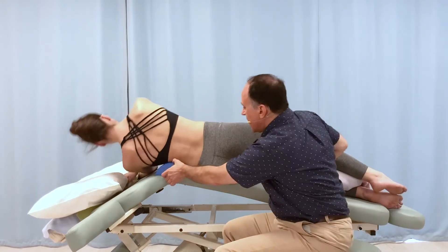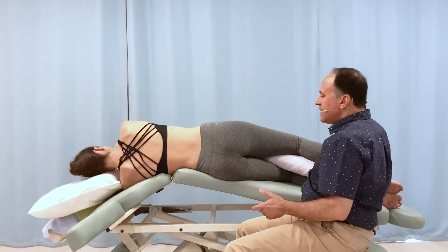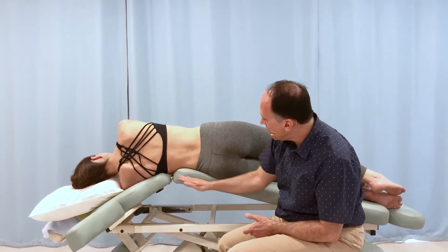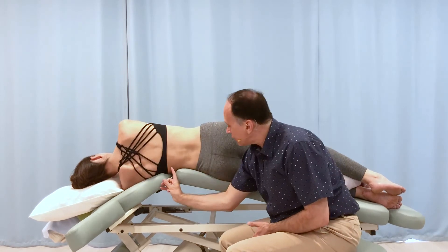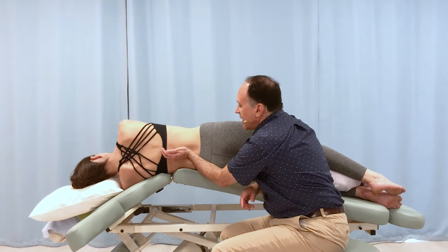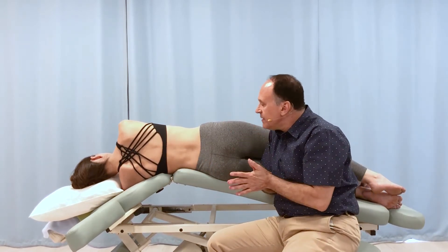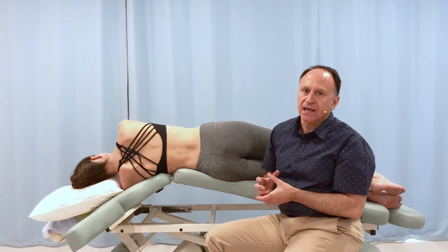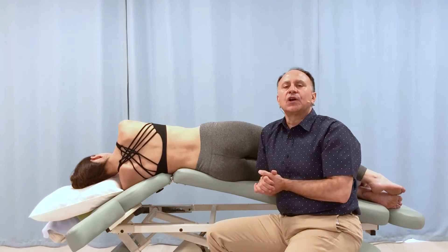After removing the bolster, you can see how the lateral flexion break does left lateral flexion around the fulcrum point, which is the apex of the convexity of the scoliosis. We can very easily and logistically stretch and focus our stretch to a scoliotic curve.